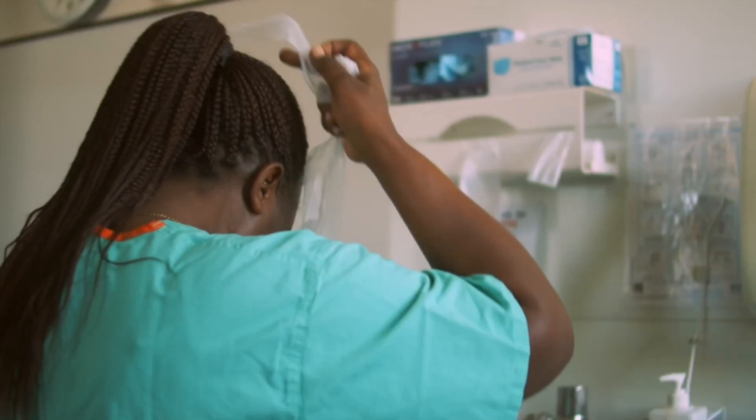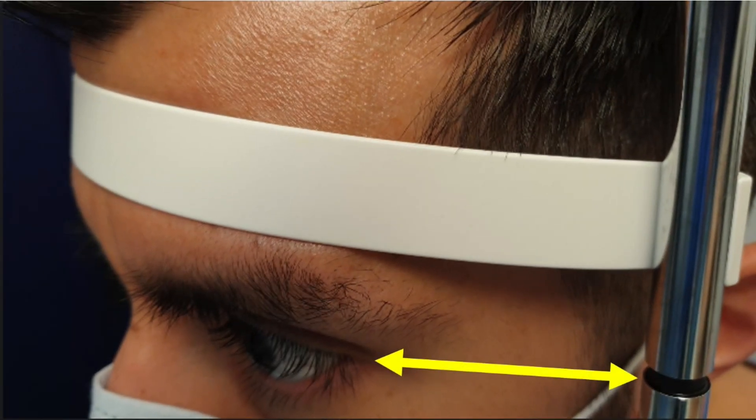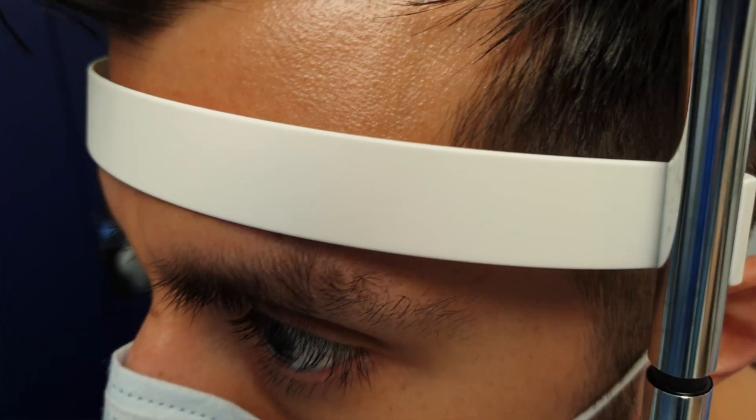Wash your hands and don PPE. If using a slit lamp, make sure the patient is seated comfortably with their eyes at the correct level and their forehead against the bar. You must keep checking this is the case during the procedure.